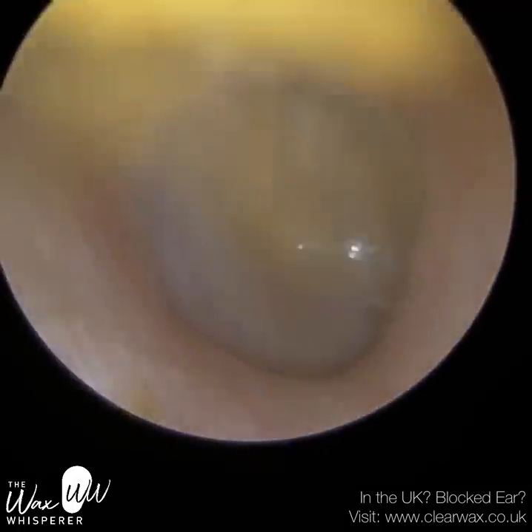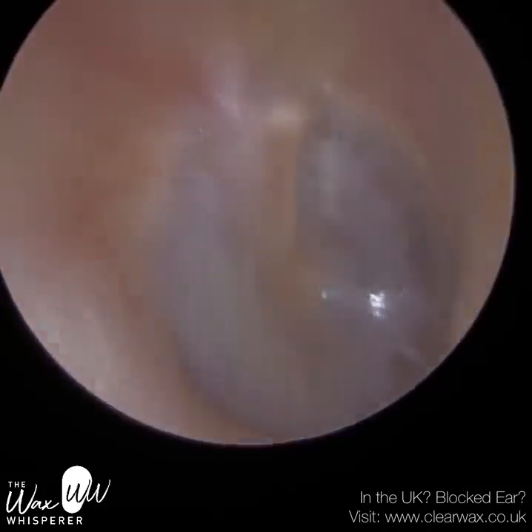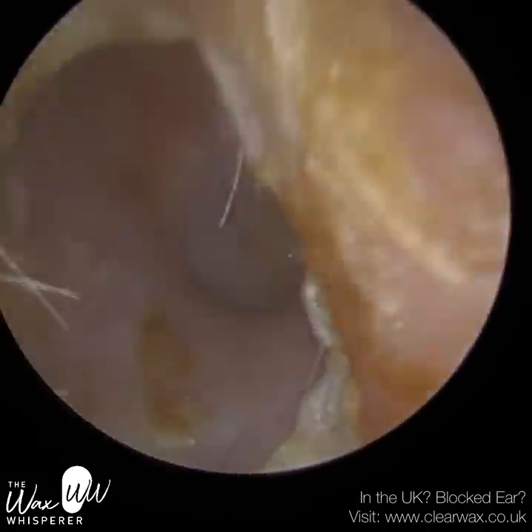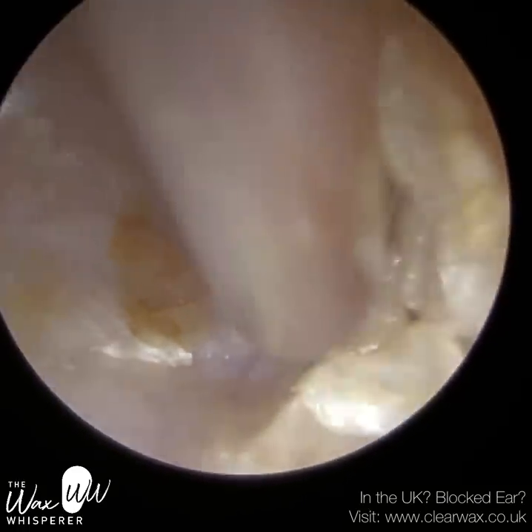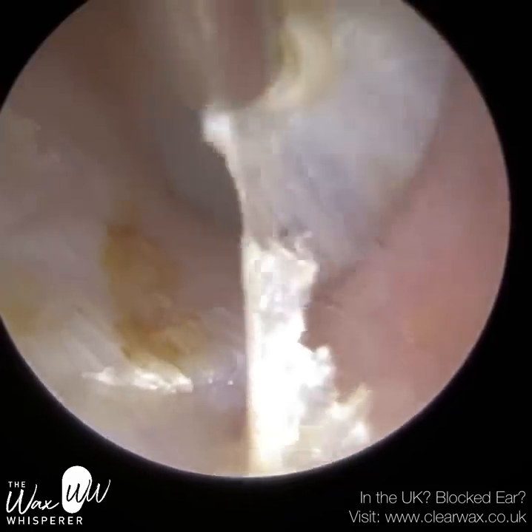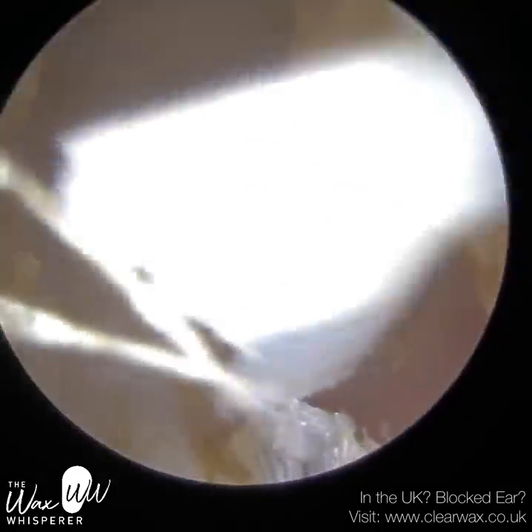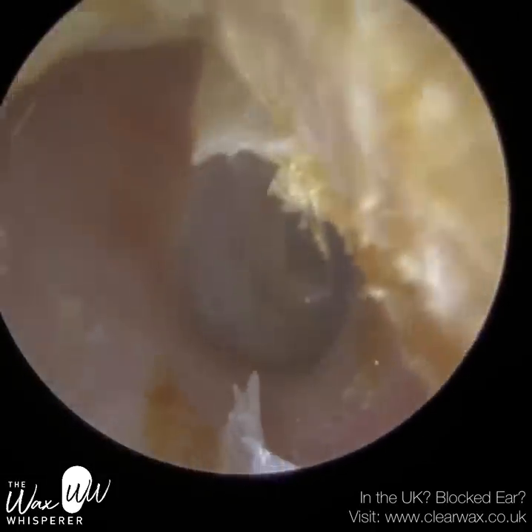As we go further in, the ear does widen, and that's the patient's eardrum — it's nice and healthy, slightly opaque. You can see these little white patches; we call that tympanosclerosis. It's a bit of scar tissue, very mild. As we get older we're more prone to that. The eardrum over many, many years, in response to — well, you can get tympanosclerosis for many reasons; it could be a chronic infection, but you'd probably see much larger white blots on the eardrum if that were the case.